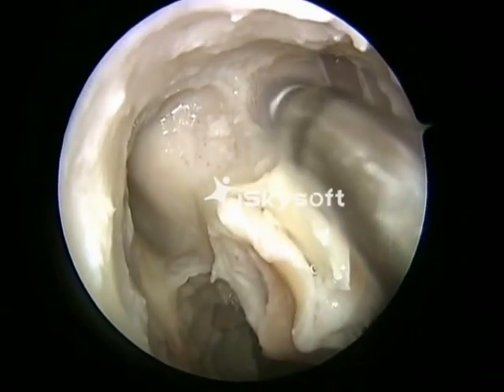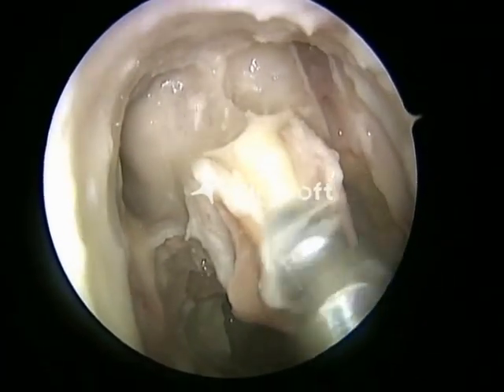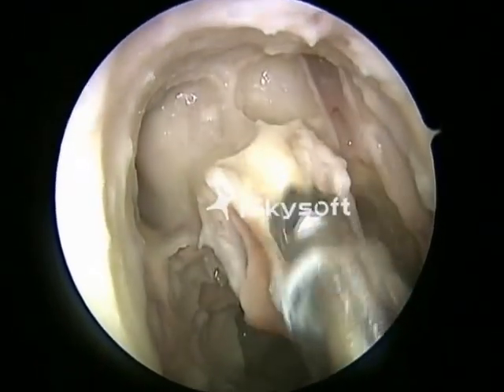We are now reducing the frontal T to convert it into an oval looking cavity.